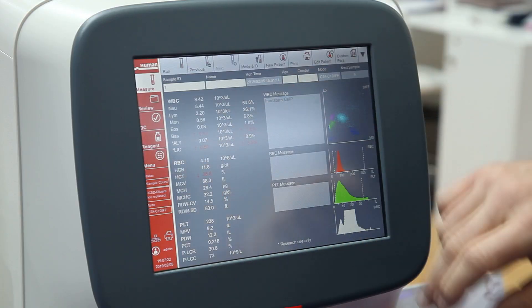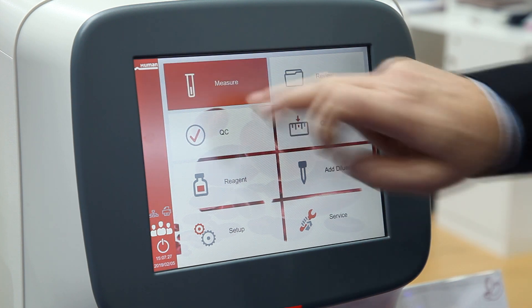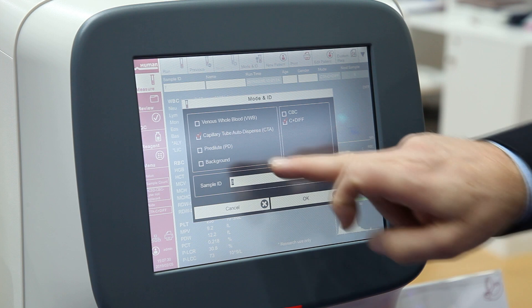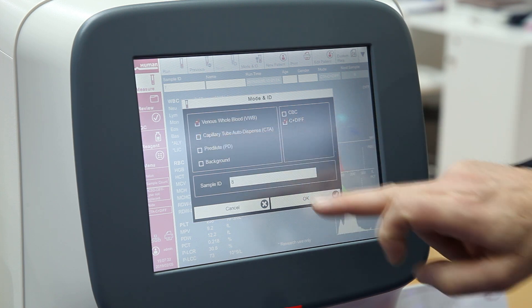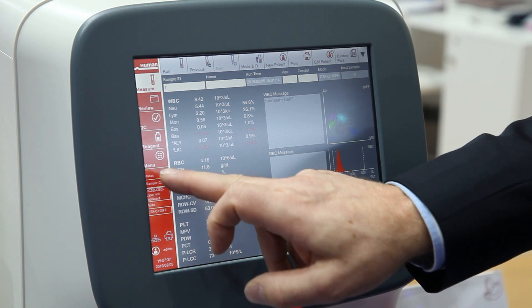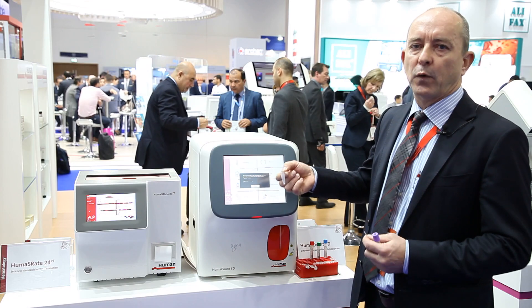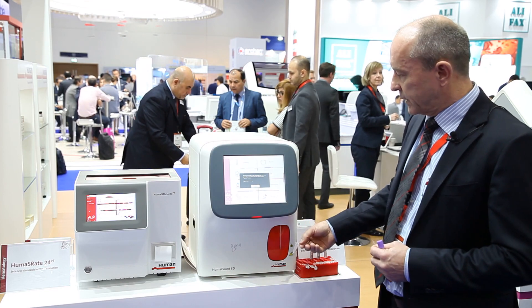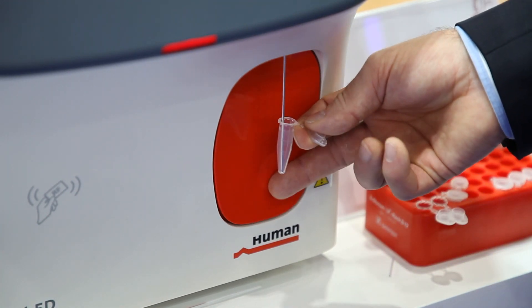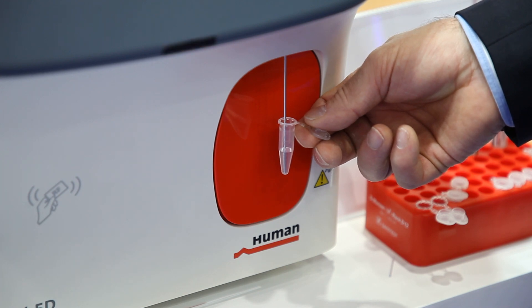Now I will show you how we proceed with the capillary samples. First, the analyzer helps you to define a defined volume for the diluent. We go to the main menu and go to 'Add Diluent,' and with the next step the analyzer will automatically fill that tube with 480 microliters of diluent. You don't have to pipette it yourself — you just press the button and the diluent gets filled in.